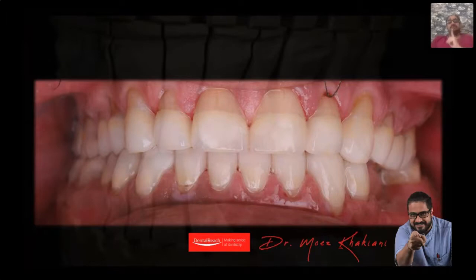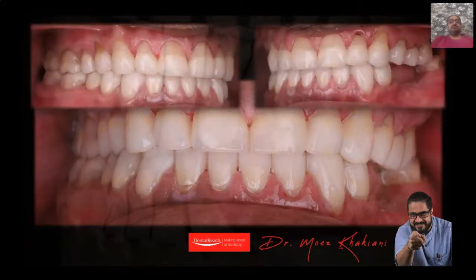Midlines are not coinciding. Do not worry if the midlines don't coincide as long as your condyles are in the correct position. Do not run behind midline coincidence. Why? Because the moment the patient loses posterior teeth, remember, the entire occlusion will shift. All right, so don't run behind getting the midlines coincident. A midline that is off axis but is straight is not an aesthetic or a functional concern. This is how it looks from the side.